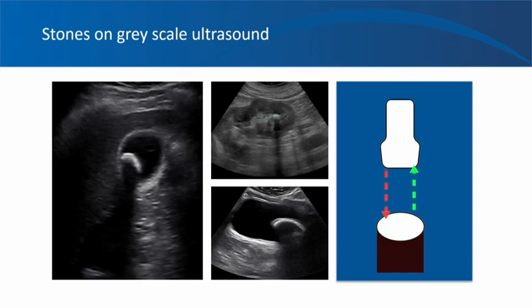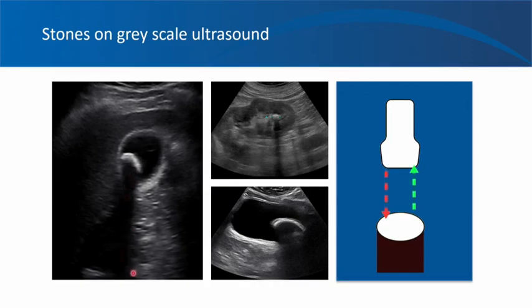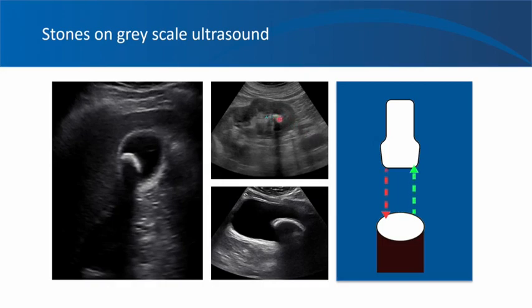Here are some examples of stones in various organs. This is the transverse section of the gallbladder with a hyperechoic stone giving a black band of acoustic shadow. And here is an example of a stone in the kidney — this is the upper pole, this is the lower pole — you see a stone in the lower pole of the kidney as a bright structure followed by a long hypoechoic to anechoic shadow.